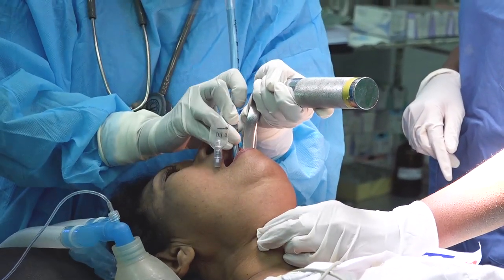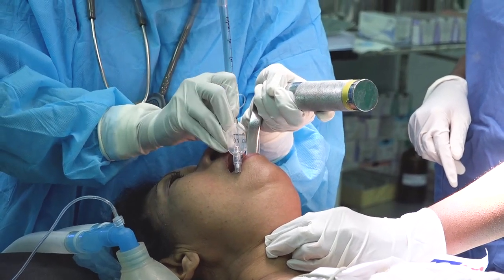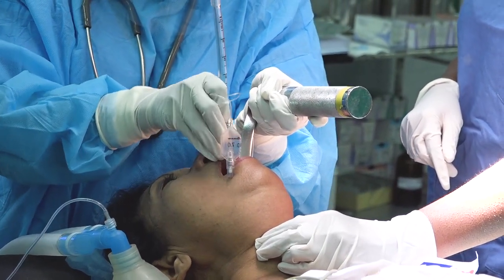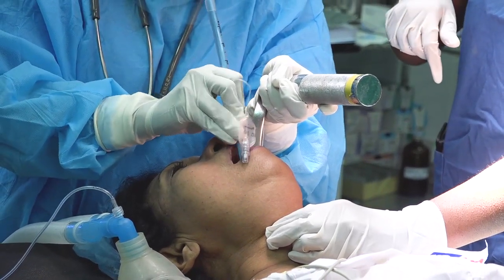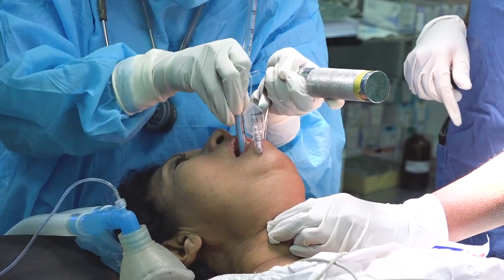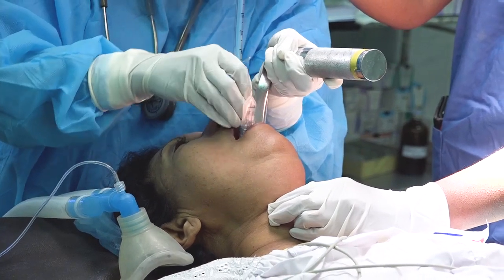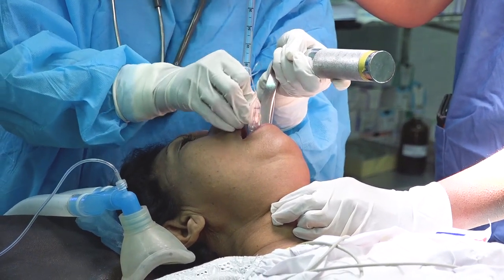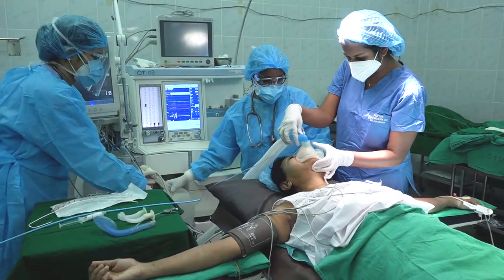In between attempts of intubation, you should maintain 100% oxygenation and deepen anesthesia with the volatile anesthetic agent. Continue monitoring and try to maintain vital parameters stable as much as possible. Right now, your consultant took over intubation, and with her experience and skills, she managed to intubate the patient.